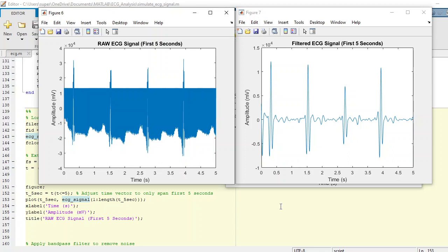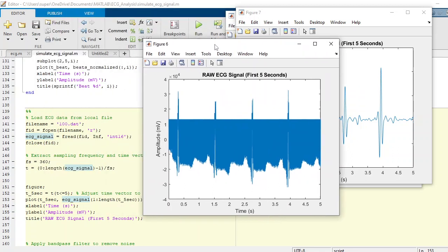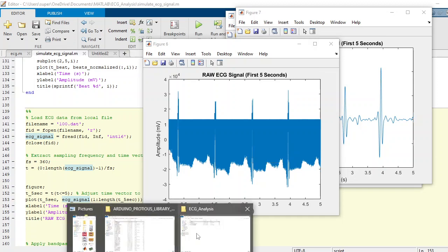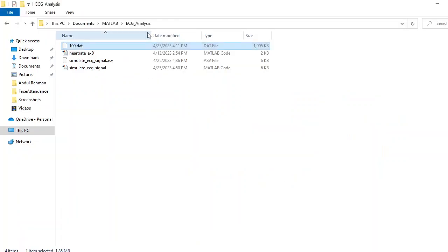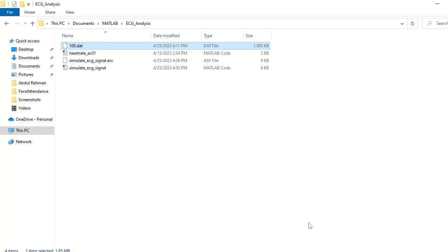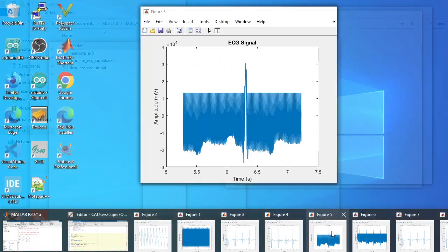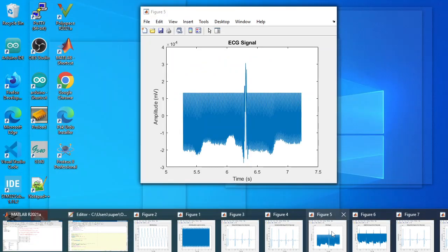This is a raw ECG signal. I am using a PhysioNet dataset and I had downloaded this file with 100.dat. This is a sample. What is happening here, I am just loading this file with the fopen function in MATLAB.